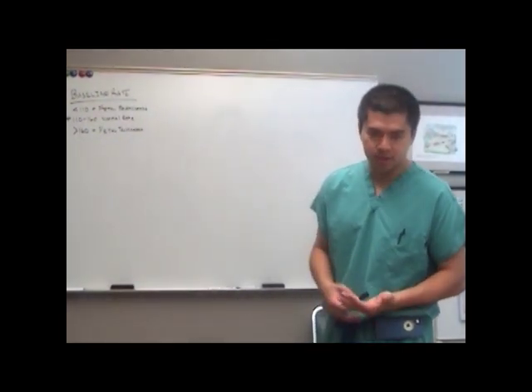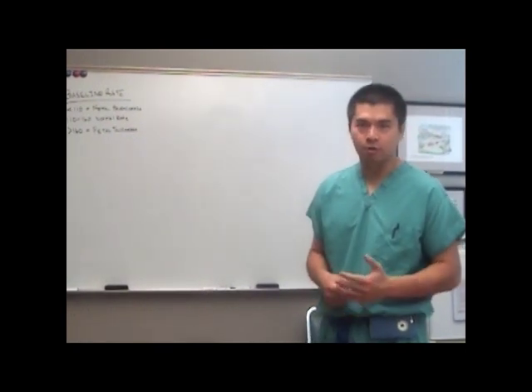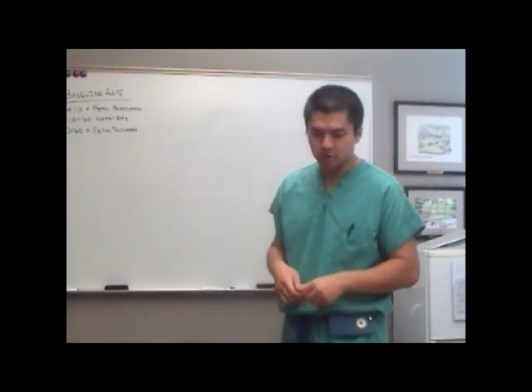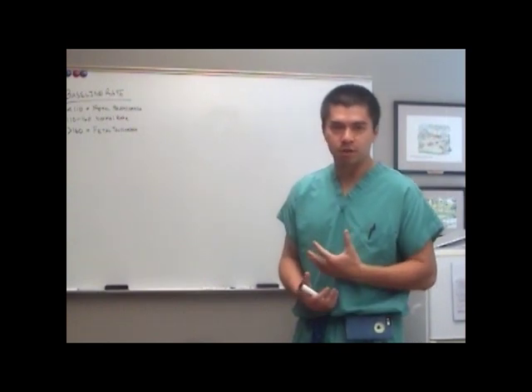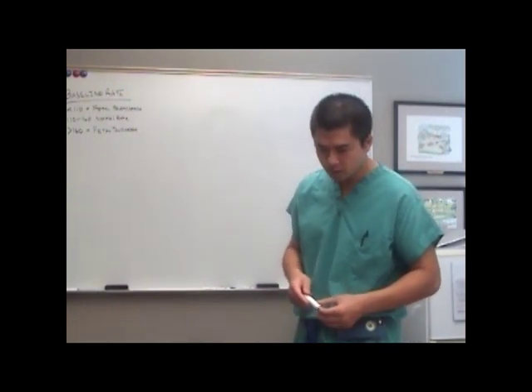Or if you need a 10 by 10, how many boxes is that? Yep, it's one small box by one small box, so 1 by 1. And so keep that in mind when you're looking at the scale. It'll help save you some time rather than having to pull up the screen or the paper and look real close at it. You'll be able to look at the screen a lot quicker.